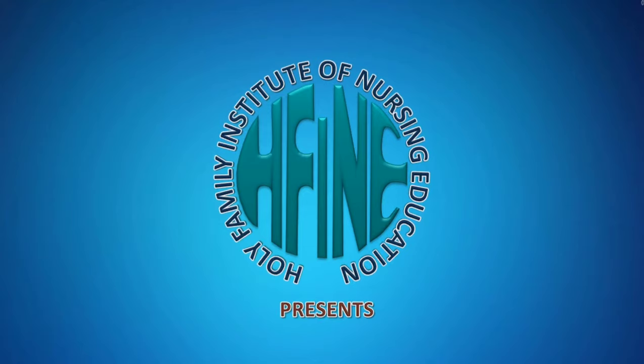Hello everyone, today we the clinical instructors along with the students of Holy Family Institute of Nursing Education would like to demonstrate a procedure on catheter care.